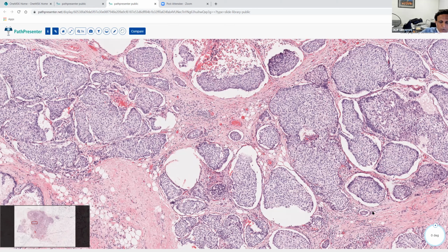Okay. So there was some confusion and controversy when some of the studies using myoepithelial stains, noting the absence of them, tried to make the argument that because there is no myoepithelial layer, these are all invasive carcinomas. So we had this absurd situation where people started sending for oncotype and all, because something was 2 centimeters or 1.5 centimeters and it was an encapsulated papillary carcinoma, but it was considered to be invasive in the absence of any myoepithelial layer.